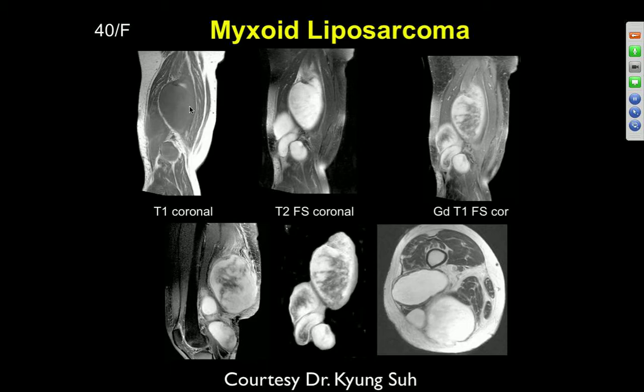in this particular lesion. There's a little inhomogeneous, and it may be a little bit brighter than the muscle around it. Much more inhomogeneous in signal intensity on the other sequences. So clearly on these other sequences, this looks more malignant with the inhomogeneous signal that we talked about as typical of malignant disease. Certainly this enhancement pattern is something that you'd be very worried about.